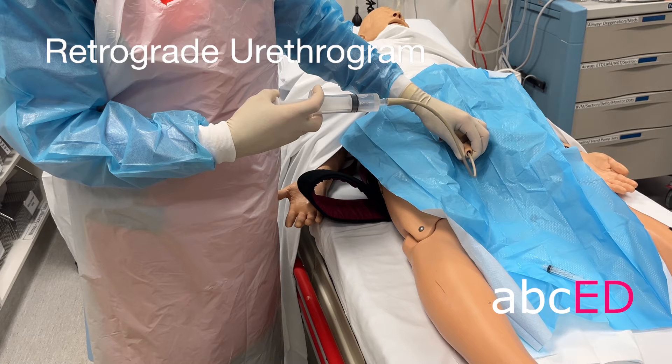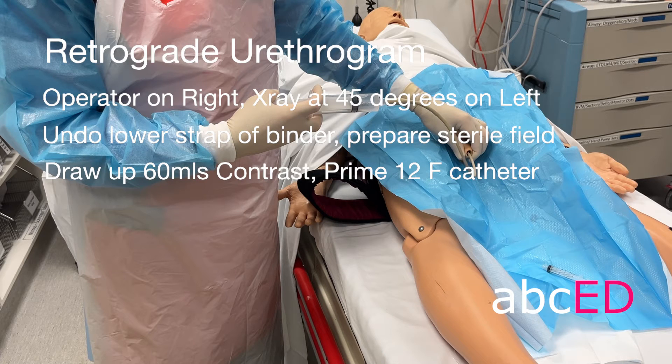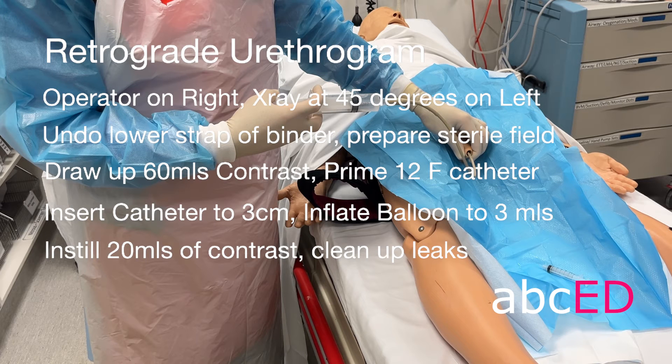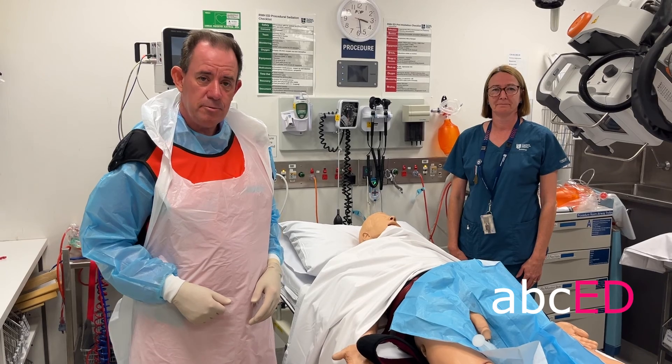Retrograde urethrogram summary: the operator stands on the patient's right, the radiographer and x-ray on the patient's left angled at 45 degrees. Undo the lower strap of the pelvic binder and prepare a sterile field. Draw up 60 mils of contrast and prime a 12 French catheter ensuring there are no bubbles. Insert the catheter 3 cm into the meatus, inflate the balloon to 3 mils or until there is discomfort, and pinch the glans to create a tight seal. Slowly instill 20 mils of contrast, clean up any leaks to avoid artifact, apply lateral traction to move the penis into an oblique position, move your hand out of the way, and take the x-ray. You may need to repeat this up to three times. And that's how we do a retrograde urethrogram.